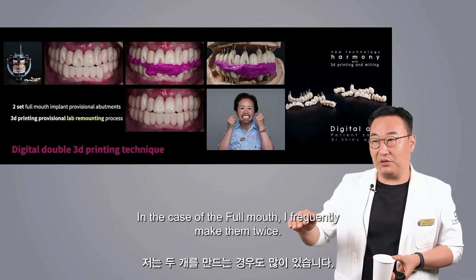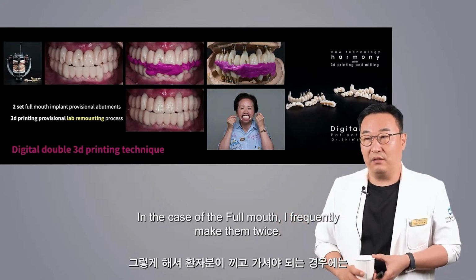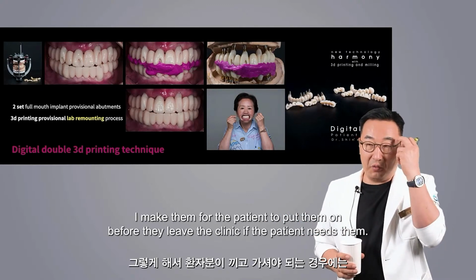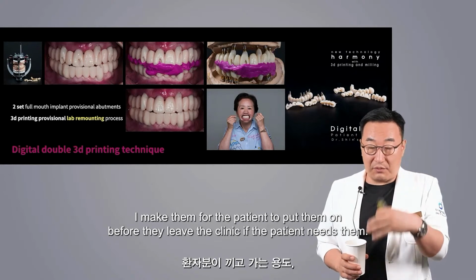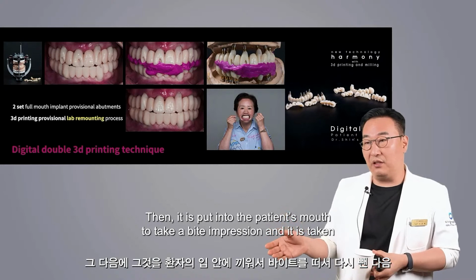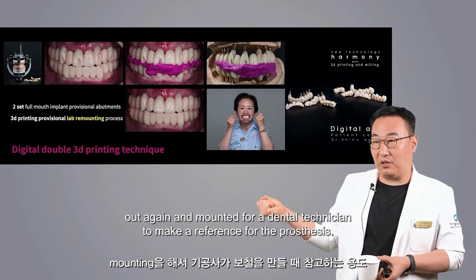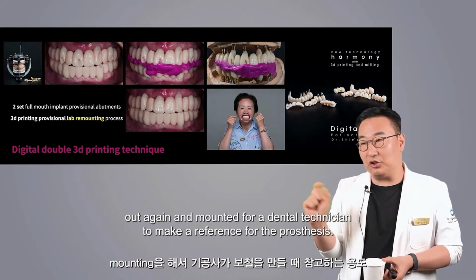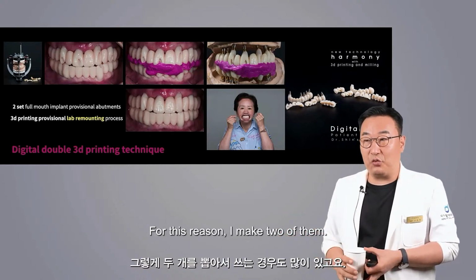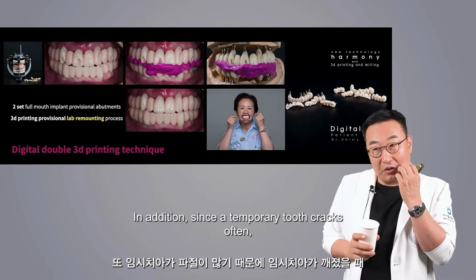In the case of the full mouth, I frequently make them twice. I make them for the patient to put them on before they leave the clinic if the patient needs them. Then it is put into the patient's mouth to take a bite impression, and it is taken out again and mounted for a dental technician to make a reference for the prosthesis. For this reason, I make 2 of them.